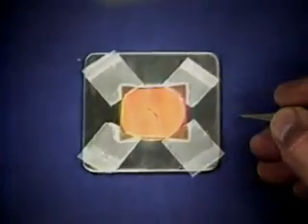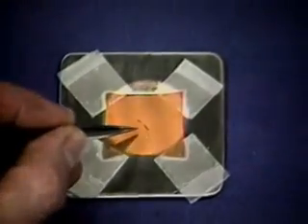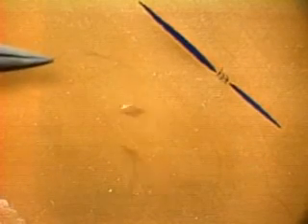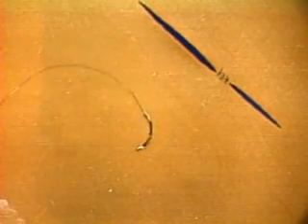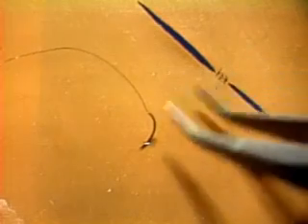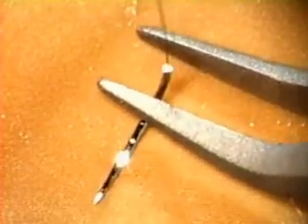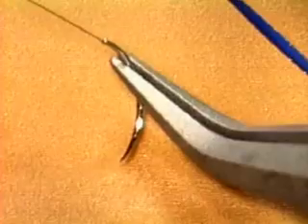Now let's see how to pick the needle up just right — there's a way that works every time. Resist the urge to go after the needle with the right hand instrument. Instead, start with the left hand instrument and use it to pick up not the needle but the thread, about two centimeters from the needle. Lift the thread straight up and dangle the needle so it just touches the flat underlying surface. By moving the thread around you can make the needle point in almost any direction — get it pointing roughly toward the bottom left. As you pick it up, touch the needle first with the near jaw of the instrument so it keeps pointing where you want.